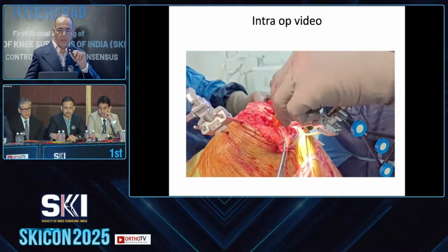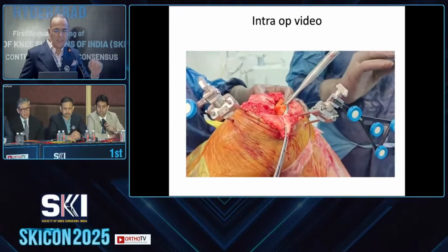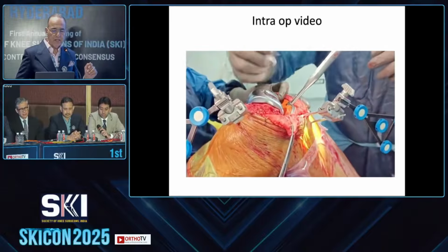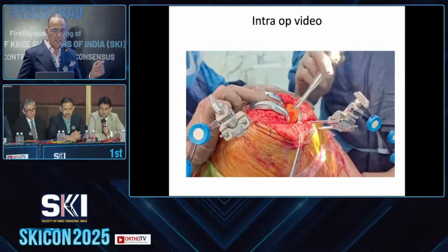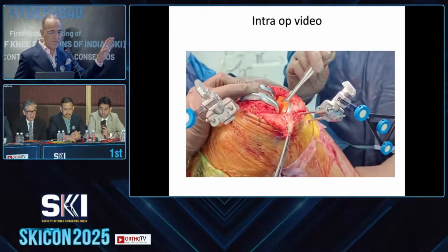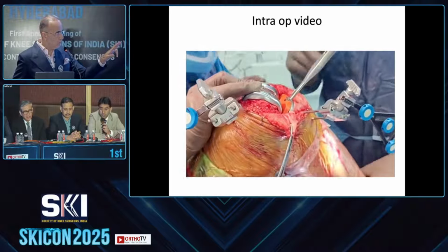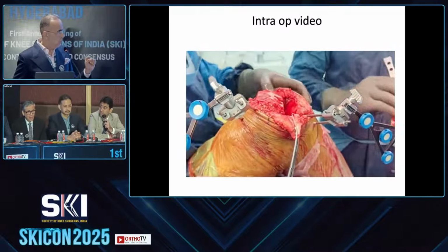So, Adarsh, let's take this case situation, where you can see that there'll be some play again. I was discussing this. So how much play would you accept with a 90-degree flexion in a multi-radius design? Is this play acceptable to you, or not acceptable? What kind of play would you accept? I would accept this play actually. You would accept this?